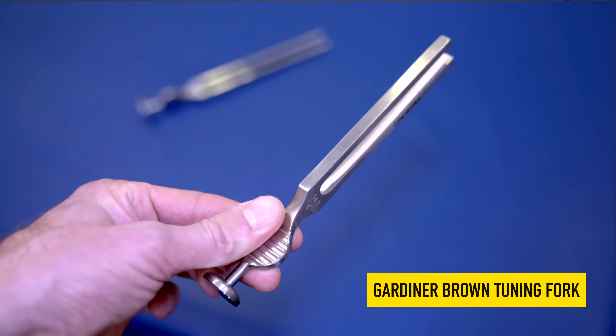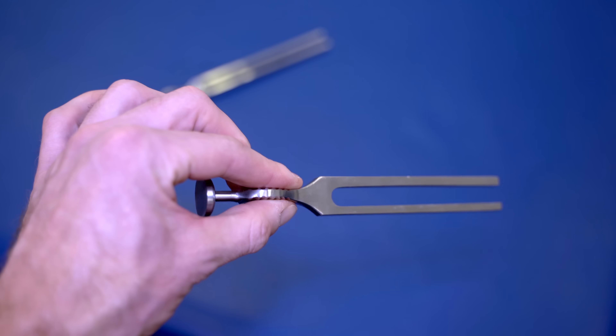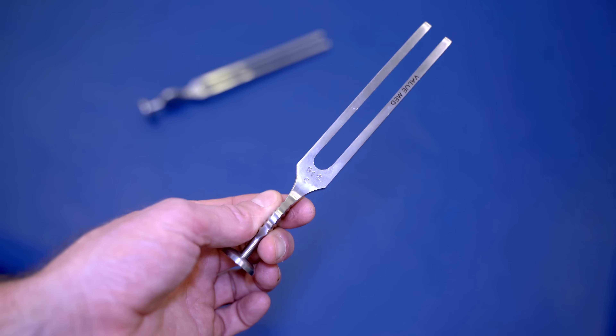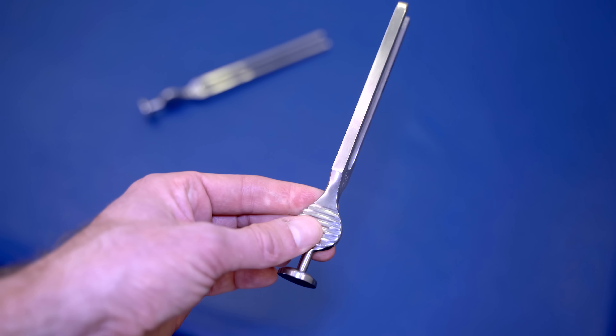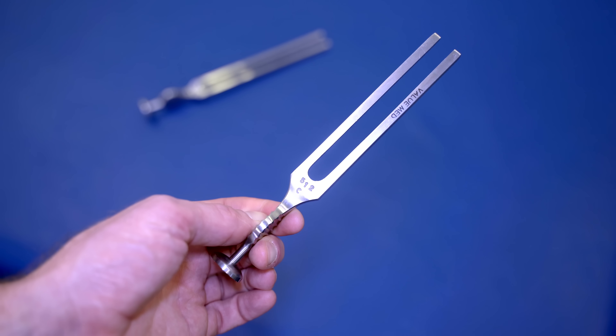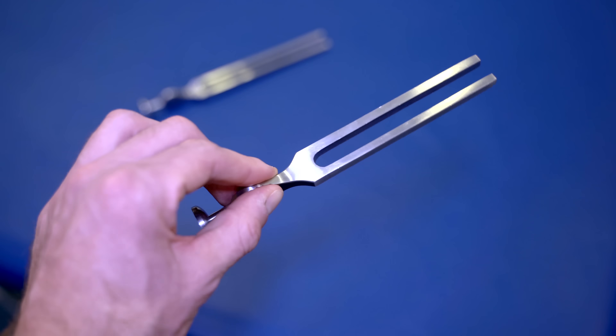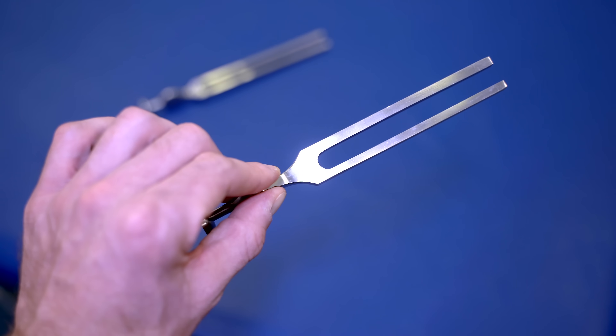There are several different types of tuning forks available. Personally I prefer this type where we can hold the tuning fork by the base and apply a flattened piece of metal to the patient as a way of stimulating them. The nice thing about these tuning forks is the plate that allows you to easily grip onto the surface.